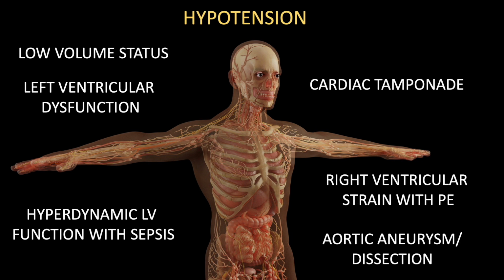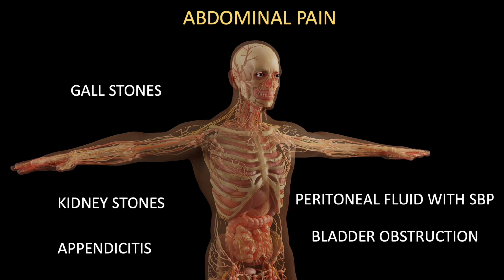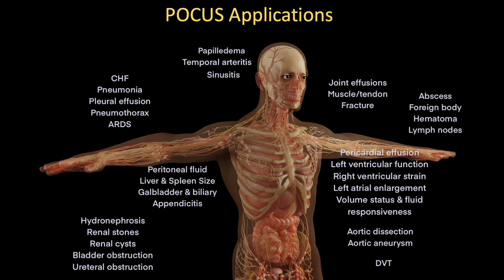As healthcare providers, we often encounter cases where a quick and accurate diagnosis is essential, but the information we need is not readily available. This is where POCUS can make all the difference. With its portability, versatility, safety, and real-time imaging capabilities, POCUS is becoming an indispensable tool in many medical specialties.